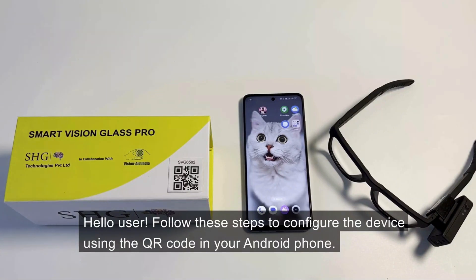Hello user, follow these steps to configure the device using the QR code on your Android phone.